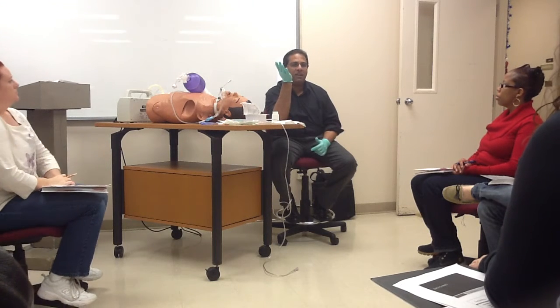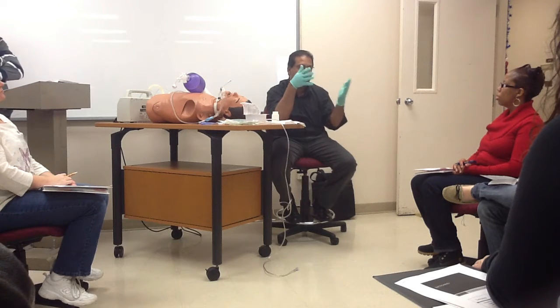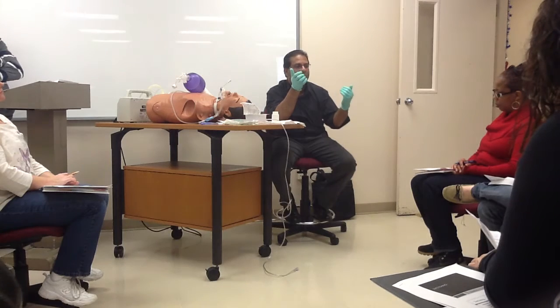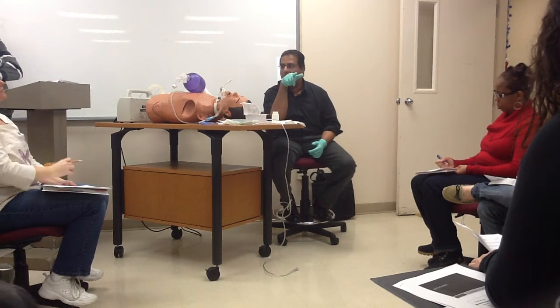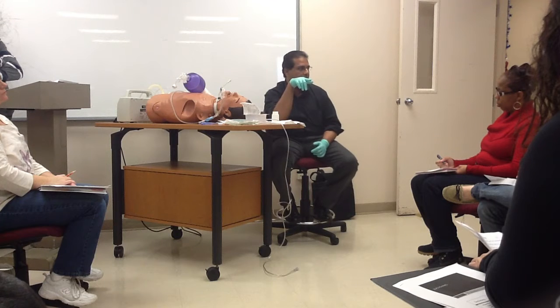10 is actually better. When you start suctioning, if you're not getting a lot of secretions with the 10, what do you need to do then? Then you go to the 12. If you have thick secretions and you can't get the stuff out with the 10, you want to go to the next step, which is 12. This stuff is on the exam, on your NBRT exam. So make sure you understand this, okay?